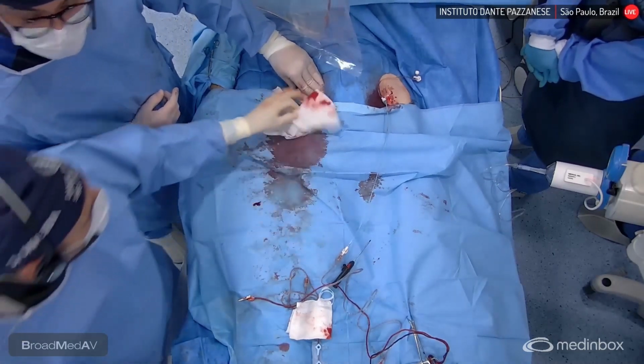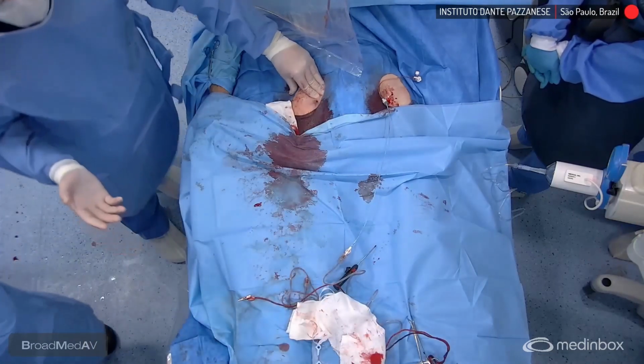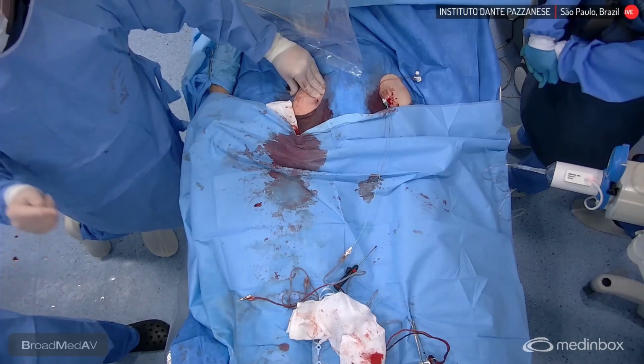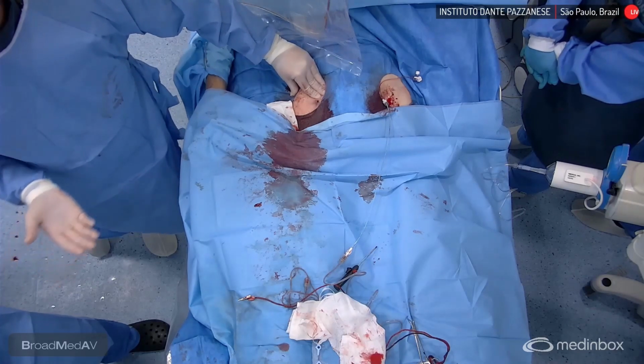What can you do to avoid a vascular complication in a patient like this, Alberto? Usually in the analysis, you have to see if we have calcifications. Usually the 360 or 270 calcifications go worse than the other patients.